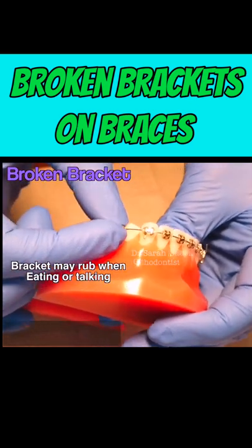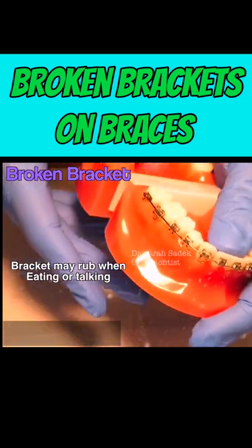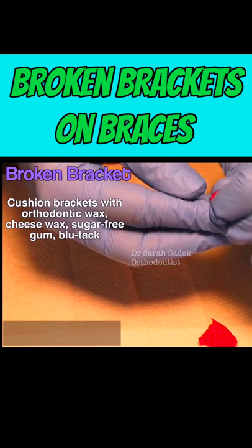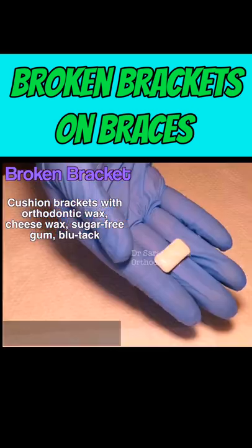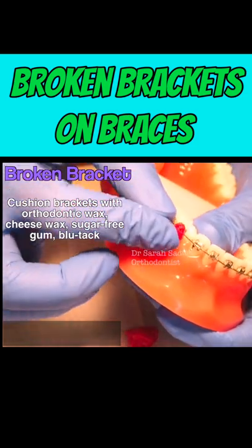If the bracket is loose and rubbing when you eat or talk, you can use some orthodontic wax which your orthodontist will provide you. There are alternatives if you don't have wax available, such as Blu-Tac, cheese wax, or sugar-free chewing gum. These can all be used to cushion the bracket.